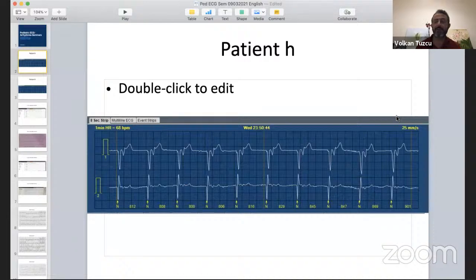Okay, so let's see. Let's assume this patient is young, therefore this QRS is a little bit wide. So it still could be junctional rhythm, because maybe there's some block, right? How do I know if this is junctional rhythm, or a block, or a ventricular escape rhythm? What should I see, or what should I do? What kind of information do I need to be able to say? Any ideas? This is a Holter. One suggestion is to look at other parts of the Holter, right? That can give us a hint.